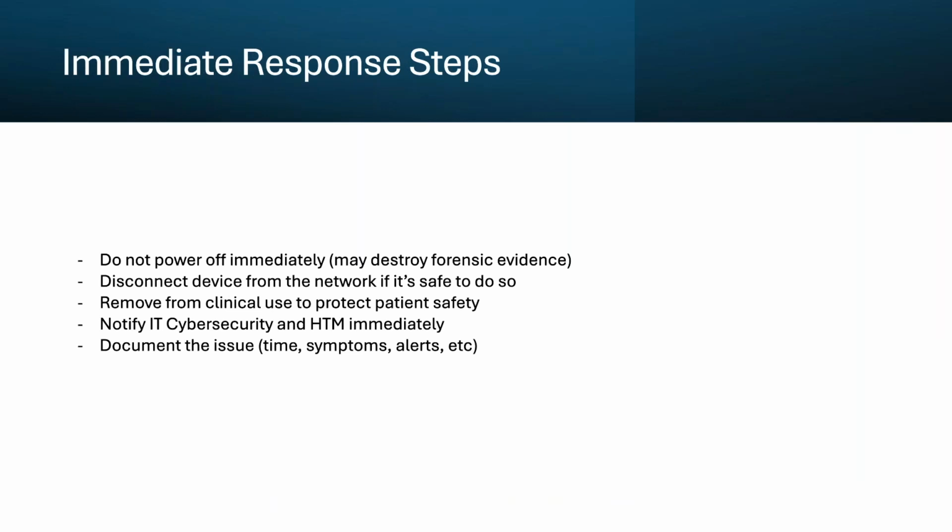And make sure you document everything, including the time, the symptoms, the alerts, and actions taken. This documentation is essential for investigations, regulatory compliance, and lessons learned. Take photos if it's appropriate, save log files, and write down exactly what you observed. Your quick response protects both patient safety and our systems.